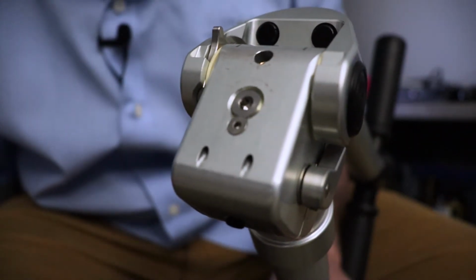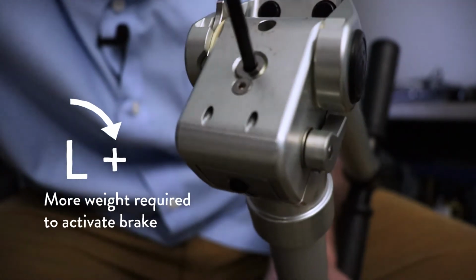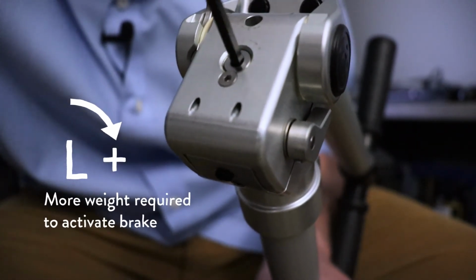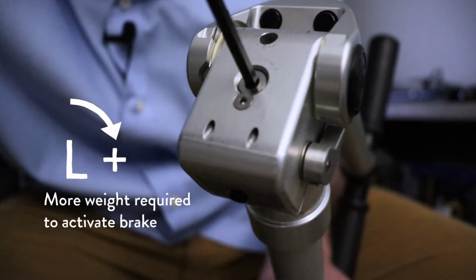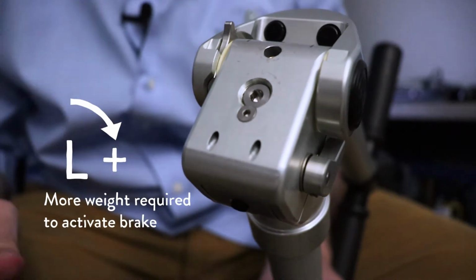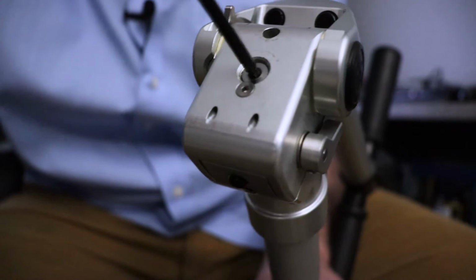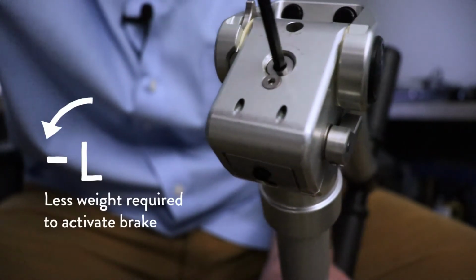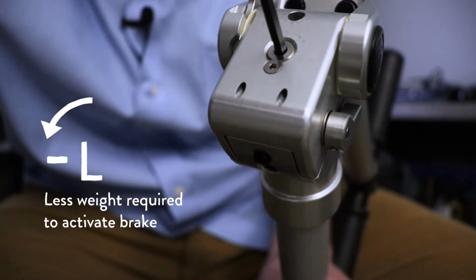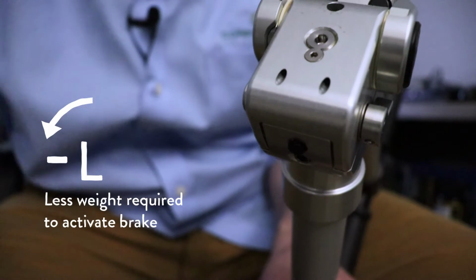Now, to increase that, we use the load dependence and we turn that to the right. I'm going to turn that clockwise towards the plus sign. We want to increase load dependence. That makes the brake less sensitive. It requires more load to activate the brake. Now if you want it more sensitive, you want the brake as sensitive as possible, then you remove that load dependence. Lower load dependence requires less weight to activate the brake.